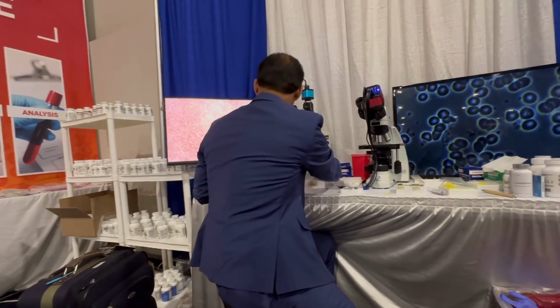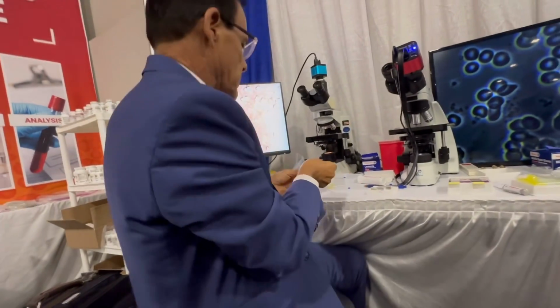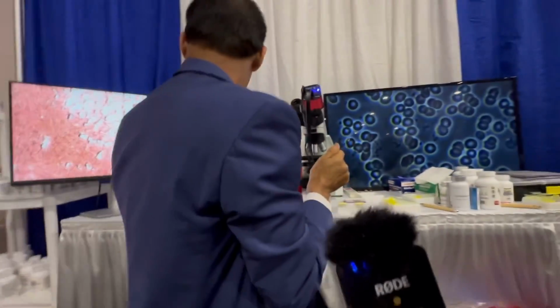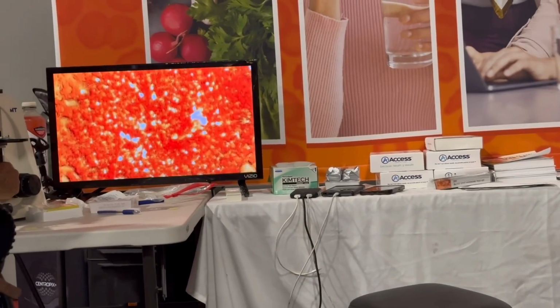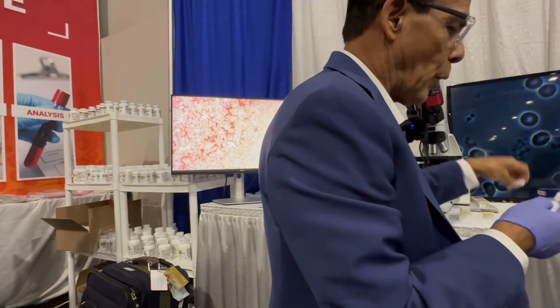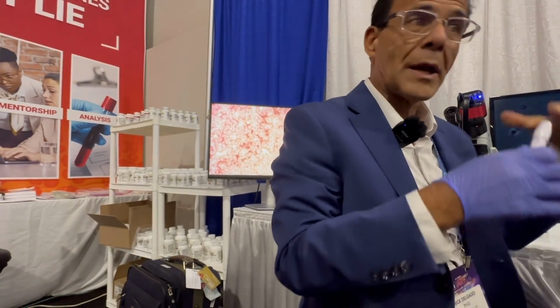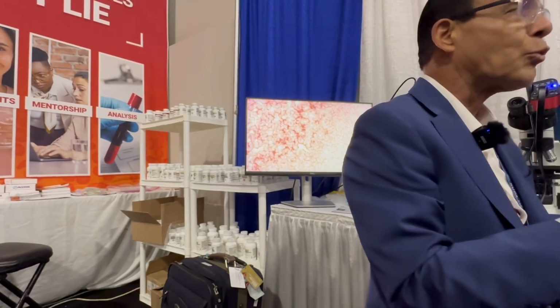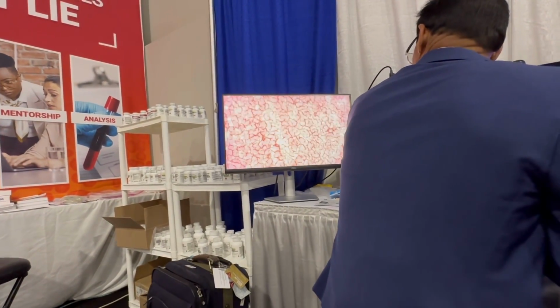Okay, so Stefan, this is you on this microscope, and the blood's starting to dry as we speak. And Nicole, this is your live blood viewing as well. And one of the first things you notice is there's some white holes, right? So you want to measure the degree and the percentage of white holes compared to red blood. Well, it looks red a little bit, right?